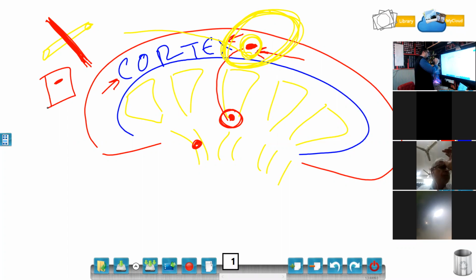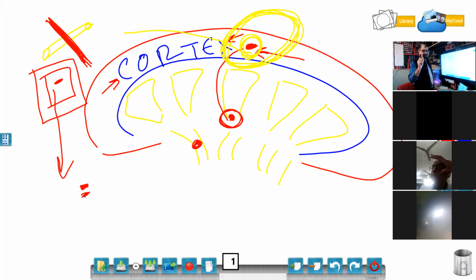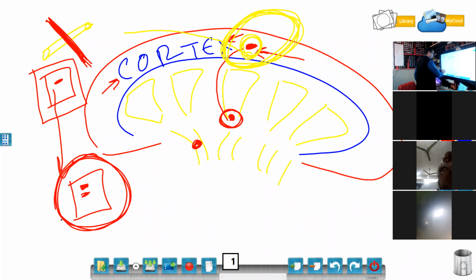Then zoom. So zoom is the last option. On zooming, you will see that these are actually two parallel dots, because this is actually a vessel. And if it is a vessel cut in cross section, it will give you a parallel sign.